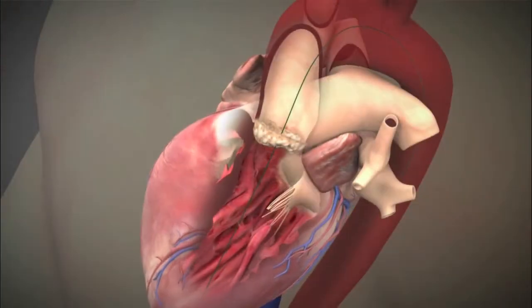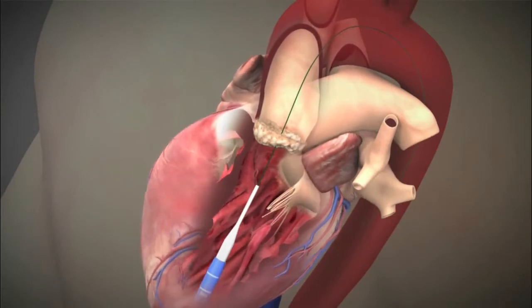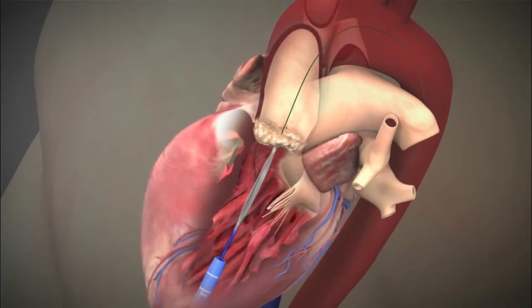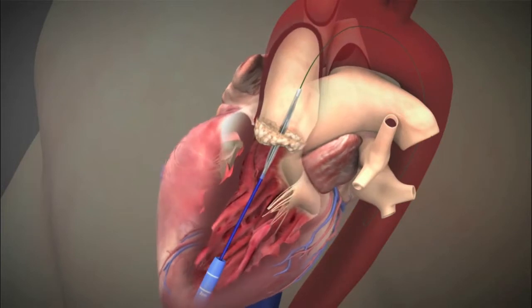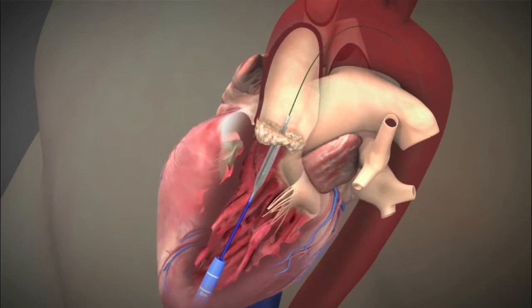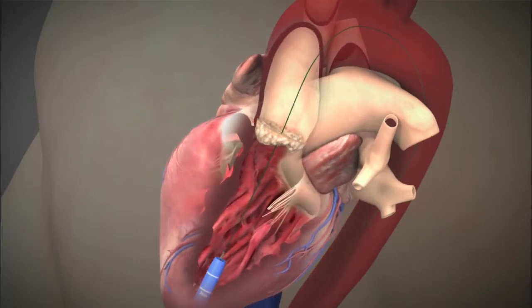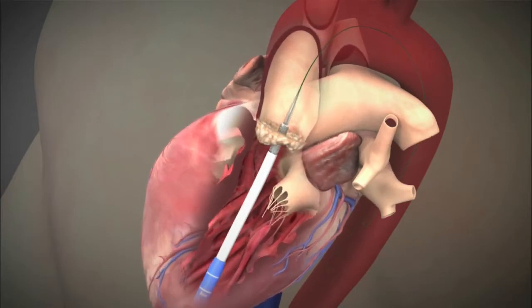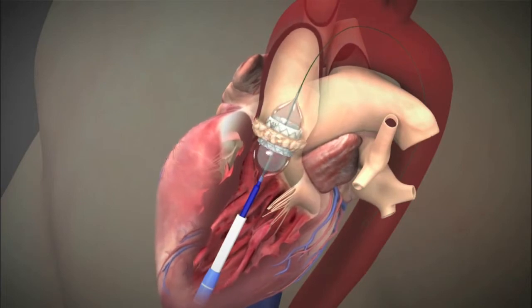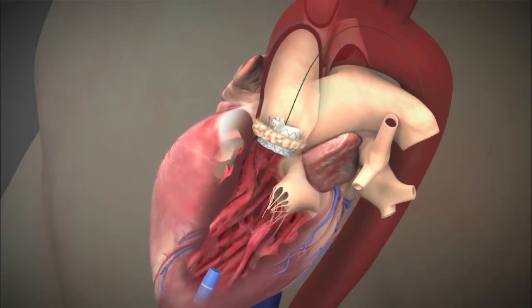An alternative procedure for those whose leg arteries cannot accommodate the catheter involves inserting the guide wire, the balloon catheter, and the valve through the apex of the heart. This is done by making a small incision in the left side of the chest between the ribs. The new valve is placed directly inside the calcified valve. The balloon catheter and valve are then inflated, which opens the stenotic valve, breaks up the calcification, frees the leaflets, and restores normal blood flow.